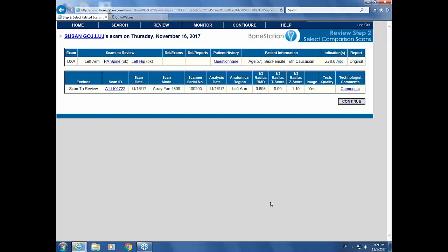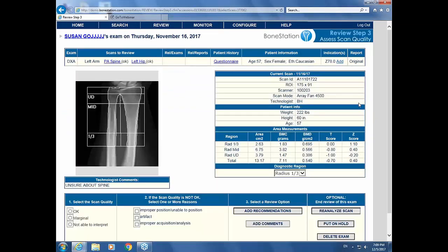We click OK and go to the forearm bone density. I want to point out the technologist comment here — the technologist wanted me to know she did the forearm because she wasn't happy about the appearance of the spine. In Hologic this is entered under scan comment; in BoneStation it appears under technologist comment, allowing the technologist to communicate with me. For the forearm, two technical things matter: it needs to be straight, which this is, and the top of the region of interest box needs to be at the tip of the ulnar styloid. We're good on both counts.